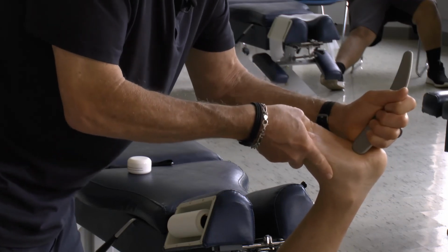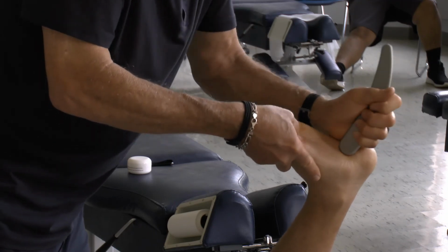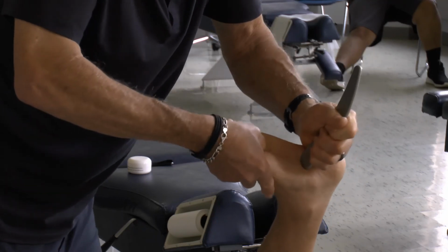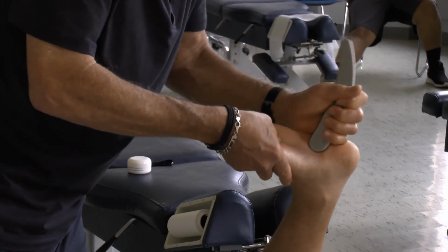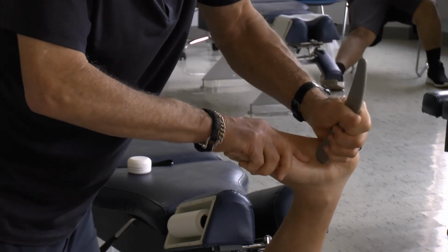You okay? And I'll mix up my directions. A little slack, a little stretch. You could switch hands here, come from different directions, but I'm going to keep it like this so that the camera can see it better.